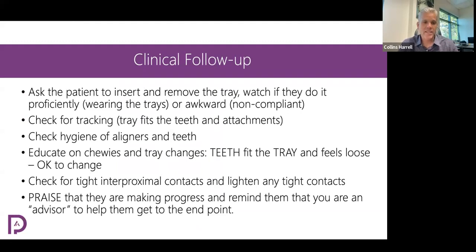As the patient comes in, I like to see my patient every 6 weeks. We are partnering with a company called Dental Monitoring. We're going to be introducing that later this year. If you do Dental Monitoring with your cases, then this whole idea will change. You'll be using AI, which we'll talk a lot more about later, to tell your patient when they can move to their next aligner, because it won't let them move until all the movements have happened. It won't let them change until they get the green check mark that they can move on to their next aligner, that all the teeth moved properly.